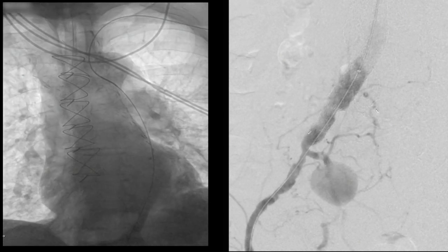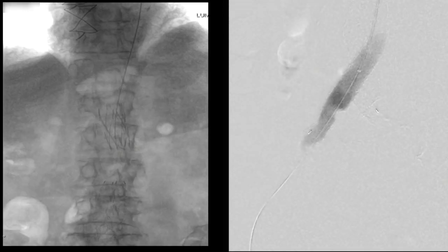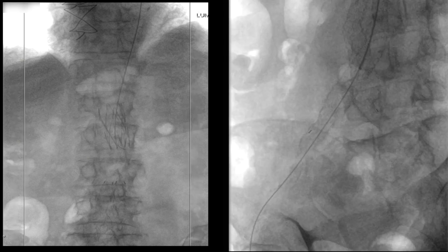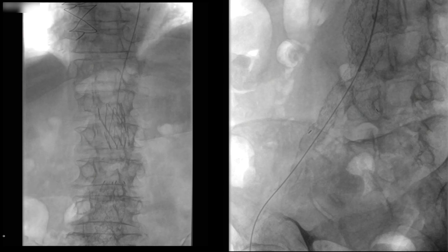One problem is that large branch which comes off fairly close to the aneurysm. We really want to make sure that we occlude that, otherwise the aneurysm could reperfuse. On the panel to your left, you can actually see the Aorfix graft which we've traversed in order to be able to get down into the aneurysm on the right side.